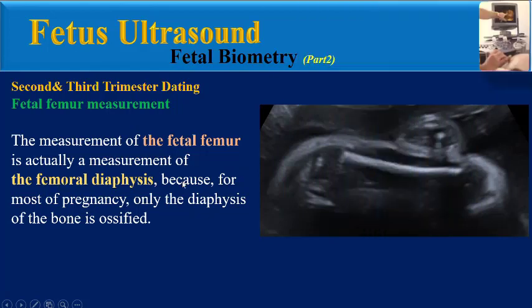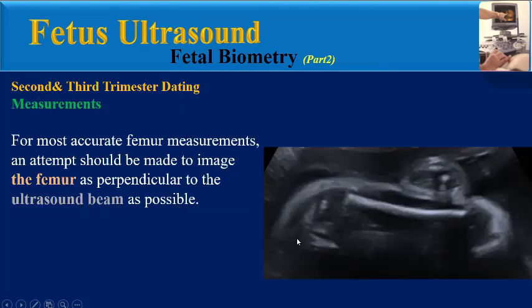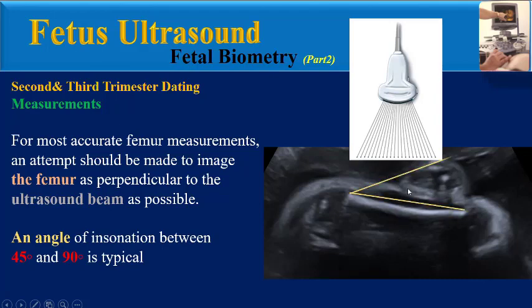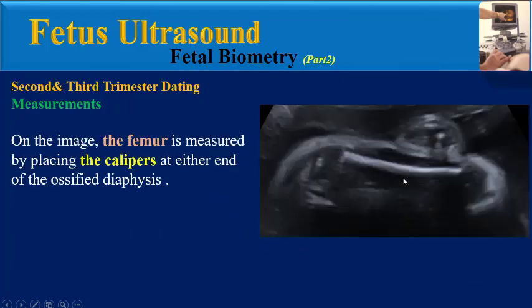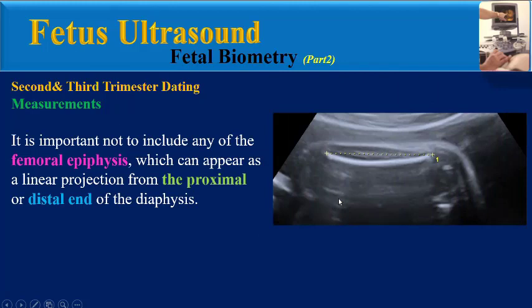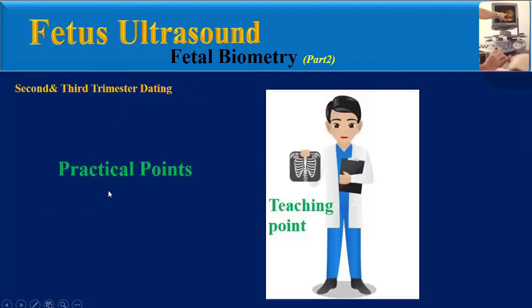For fetal femur measurement, what is actually measured is the femoral diaphysis, because for most of pregnancy only the diaphysis is ossified. For the most accurate measurements, the femur should be imaged as perpendicular to the transducer beam as possible, though an angle of insonation between 45 and 90 degrees is typical. The calipers are placed at either end of the ossified diaphysis. It is important not to include any of the femoral epiphysis, which can appear as a linear projection from the proximal or distal end.